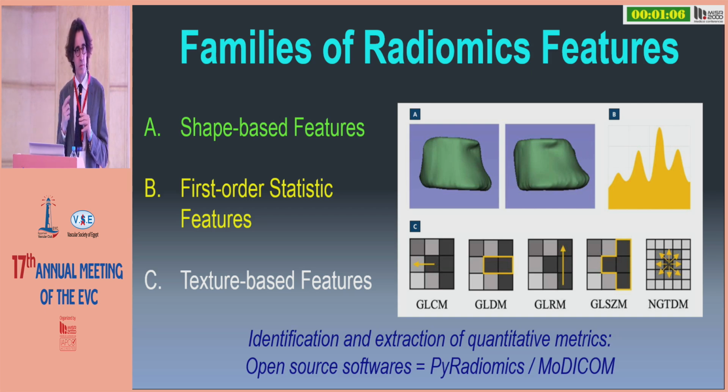You can ask the machine, for example, to tell you for the central voxel or pixel that they are looking at, what are the relationship with all the voxels and pixels surrounding them. So this is just to say that it's a way of looking at imaging that we are not used to at all. It's not the conventional way we look at a CT scan. So what you see here is what the machine would look at and interrogate on a CT scan.